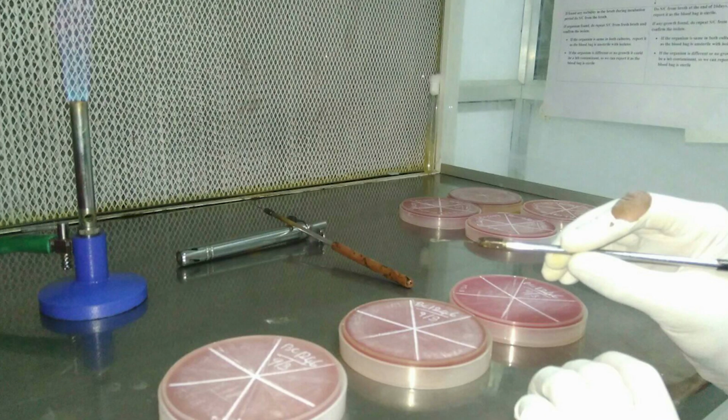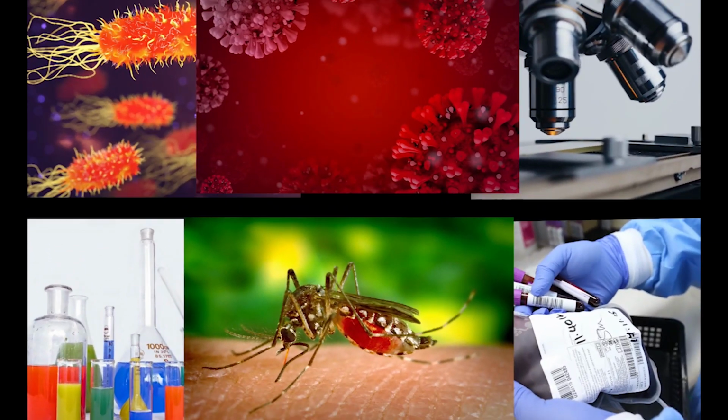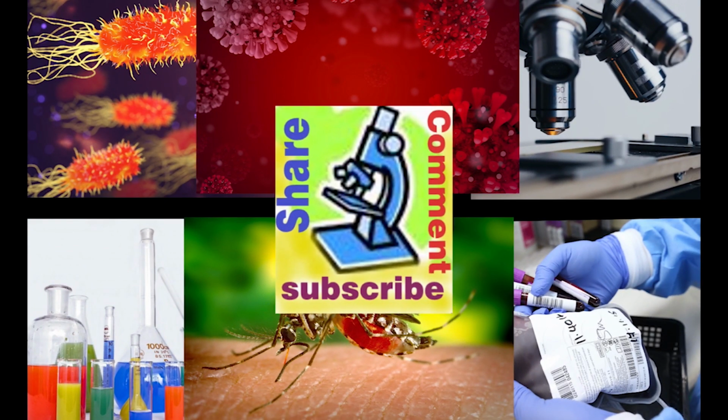Likewise, if a specimen is collected from a source likely to be contaminated with normal flora, we need to add a special selective medium to suppress the normal flora and allow the pathogens to be recovered.